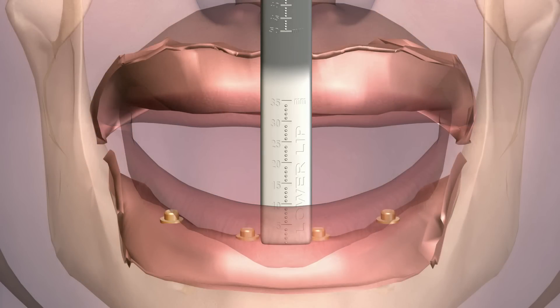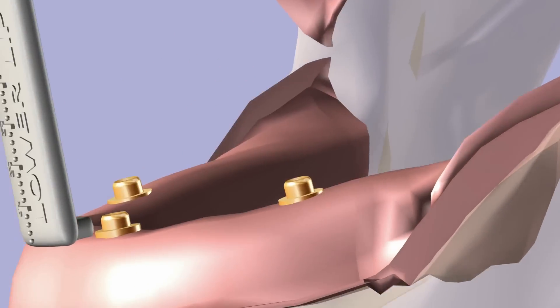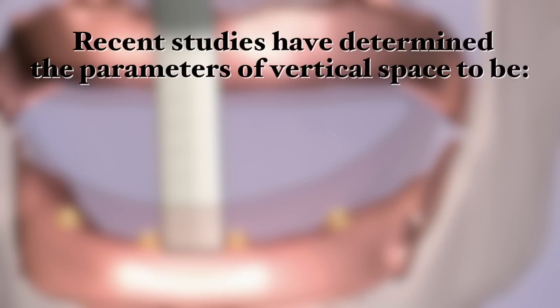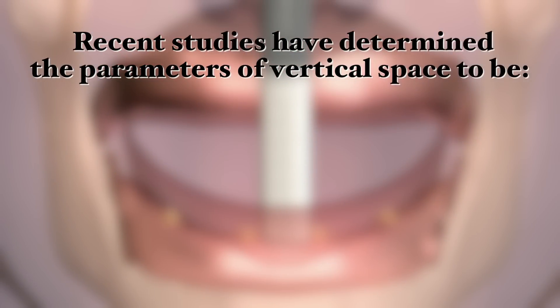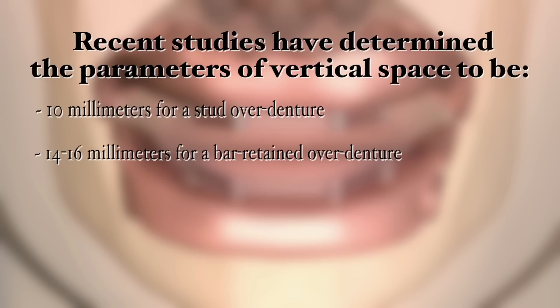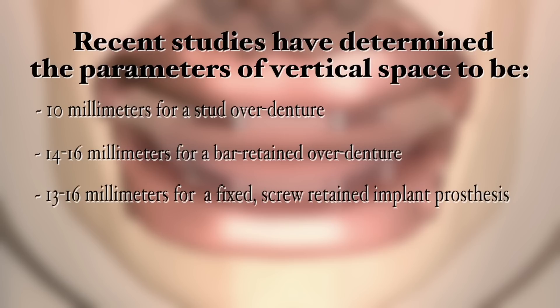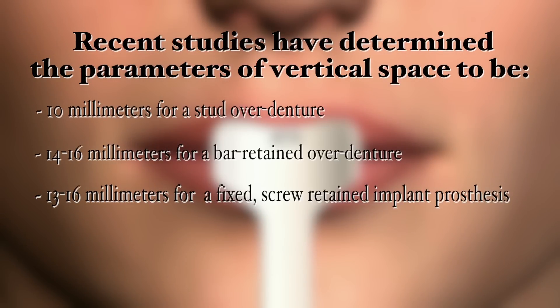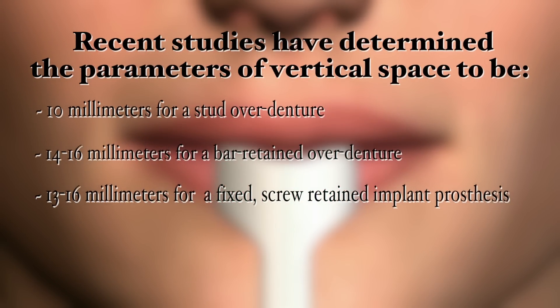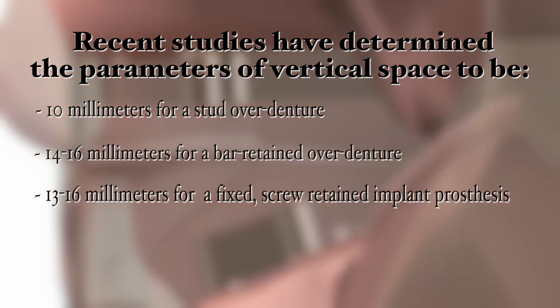When diagnosing and treatment planning the type and design of final implant restorations, it's critical to understand the space requirements as part of the implant prosthesis selection. Recent studies have determined the parameters of vertical space to be approximately 10 millimeters for a stud overdenture, and 14 to 16 millimeters for a bar retained overdenture. A fixed screw retained implant prosthesis requires approximately 13 to 16 millimeters if the final prosthesis is to fit naturally within the facial mask and be aesthetically pleasing and natural feeling.